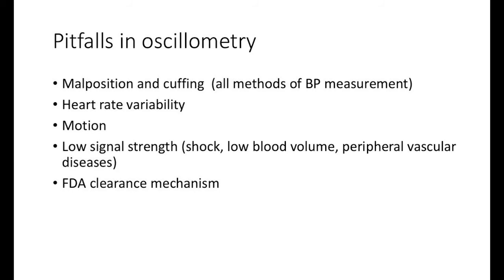And the issues that are just limiting for oscillometric use are often things like in the field when someone's down with an injury or whatever. If they have a relatively low blood pressure, the oscillometric signal strength isn't good enough. Or if they're in an ambulance and being jostled, like I mentioned, you're dealing with a 3 millimeter pulse pressure. And especially in Philadelphia, where it's a pothole city, as the ambulance is hitting pothole after pothole on the way to the hospital, the arm's bouncing all over the place and you can't really get a very good answer.